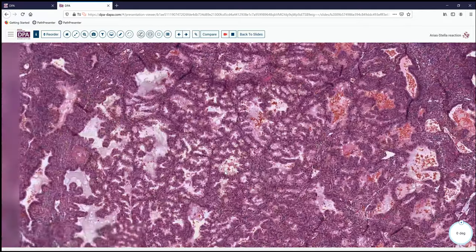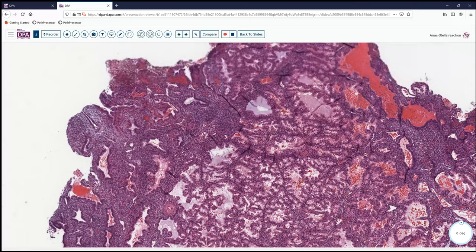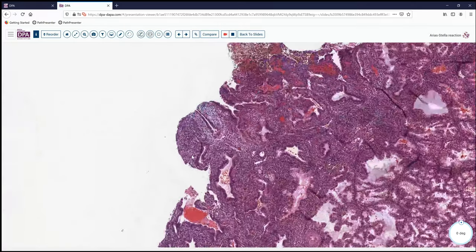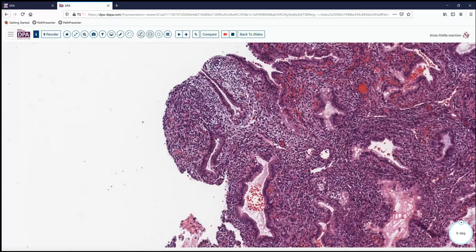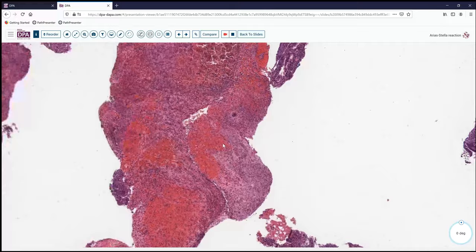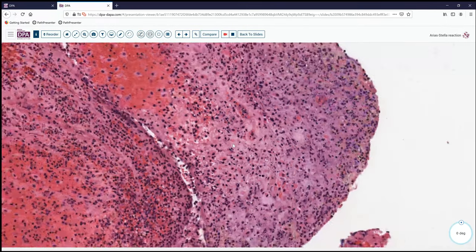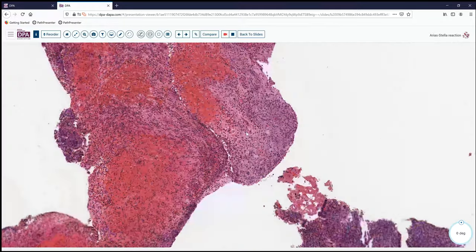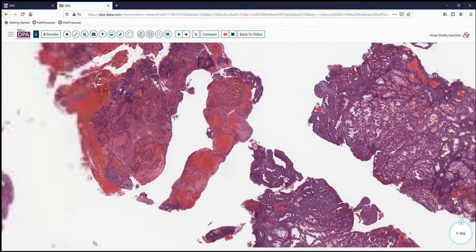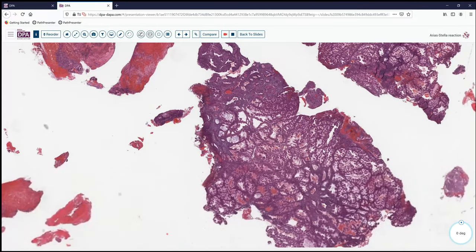In this case, there is relatively little stromal decidual change. As we look around, we see very little decidualization, maybe a little bit here with that edema and so forth, and maybe some over here in these more necrotic areas where there might be some of that reaction. By and large, it's all hemorrhagic and necrotic tissue with this very pronounced hypersecretory pattern that forms a nearly back-to-back glandular tissue.